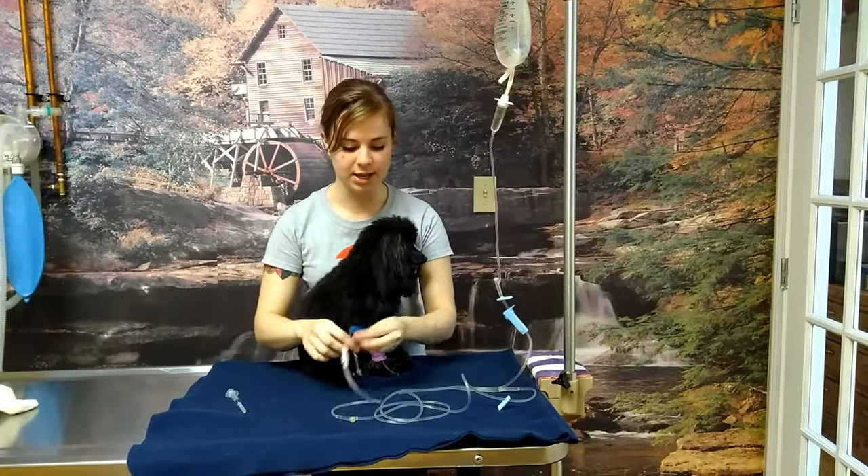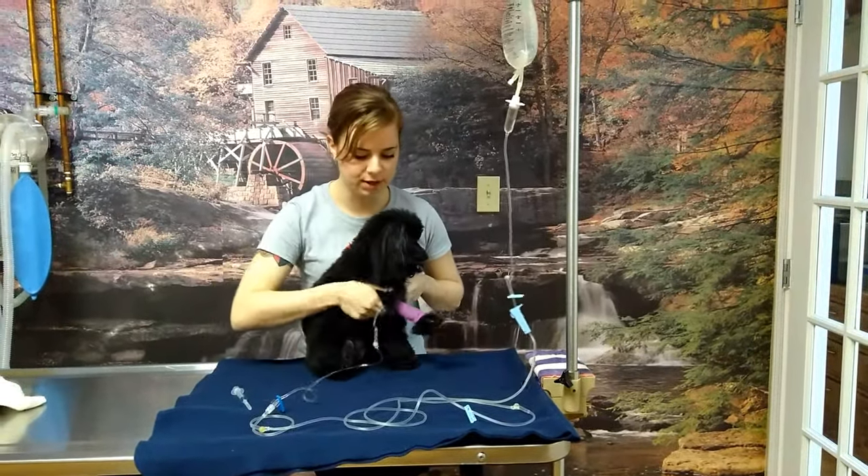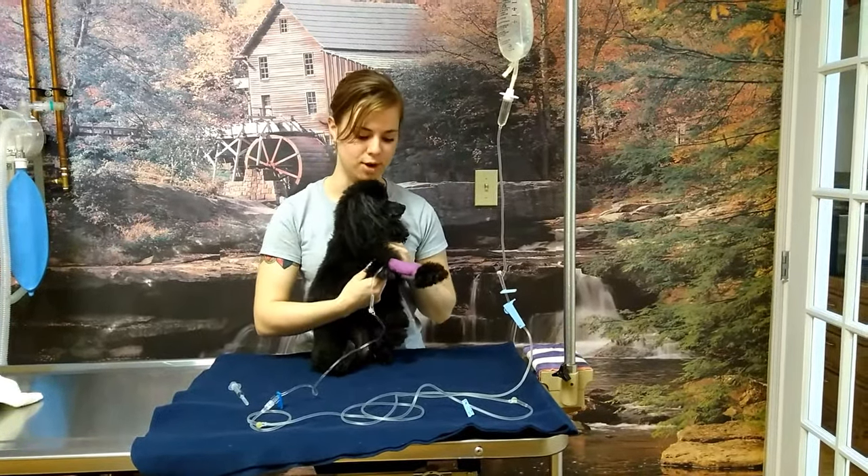Now if everything is open and it's still not dripping, you want to check the line for kinks and straighten out your pet's arm. Sometimes the kink in the elbow can stop the fluid from running properly.